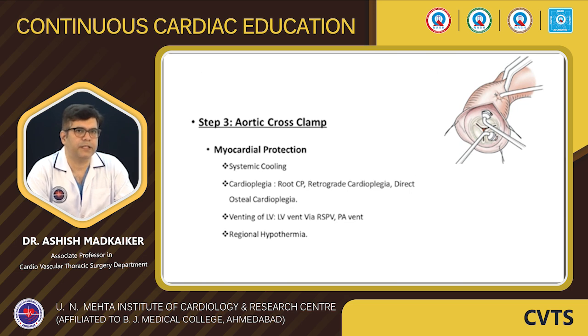Next step is to cross-clamp the aorta. Now, when we come to the stage of cross-clamping the aorta, myocardial protection has to be given due importance. Following are the common principles which we need to follow in achieving good myocardial protection, and it cannot be emphasized more than enough to prove this point that good myocardial protection is very essential for good outcome following cardiac surgery.